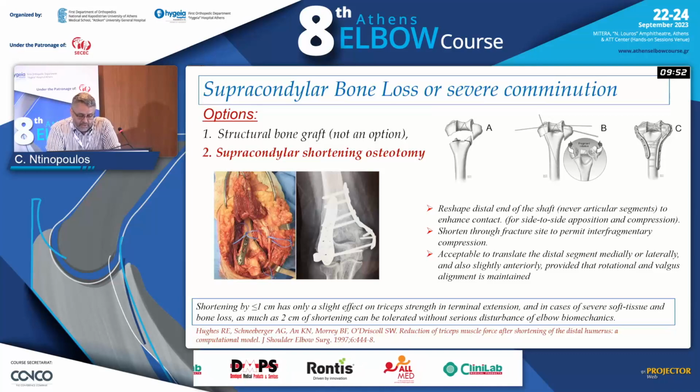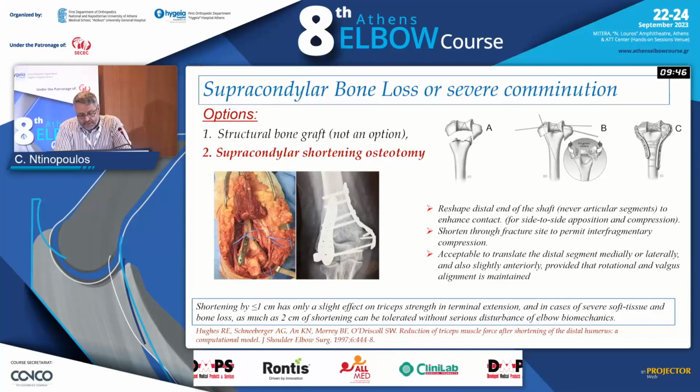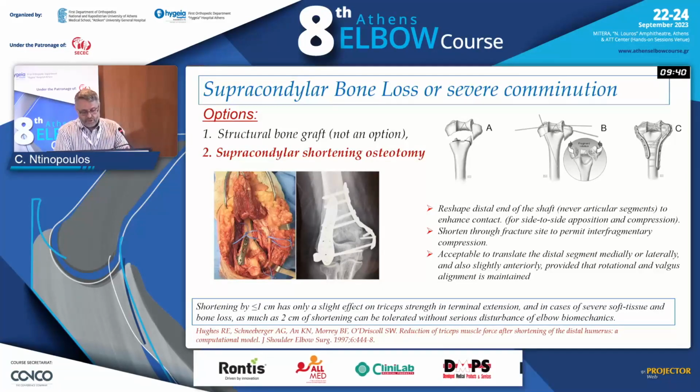We cannot change the valgus, and we can fix it in a slight anterior position, not posterior. So anteriorly shortened, do not disturb the valgus, do not disturb the rotation.